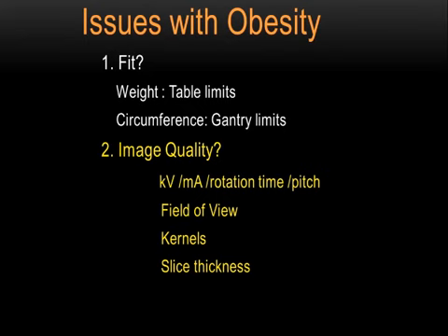The other thing is that if you can move the table, the patient then has to go in and out of the CT gantry, especially if you're going to do a chest and abdomen CT. This is not as crucial in head CT, where the head doesn't really become big. So it's not going to be an issue, but it will be an issue for chest and abdomen.